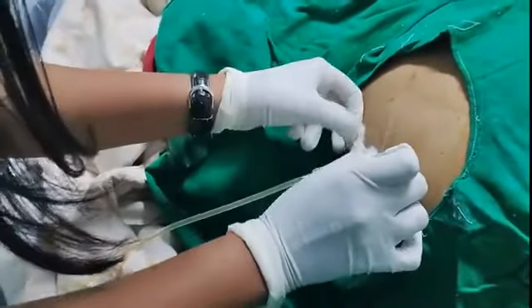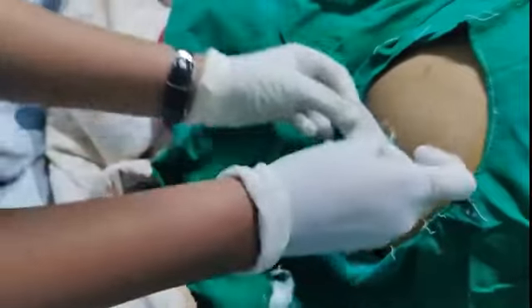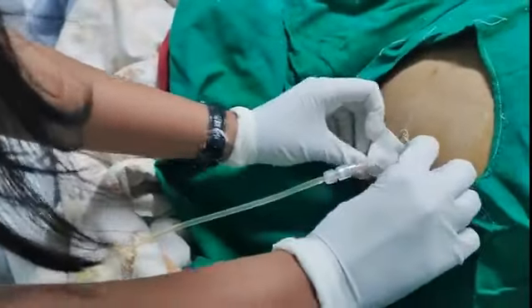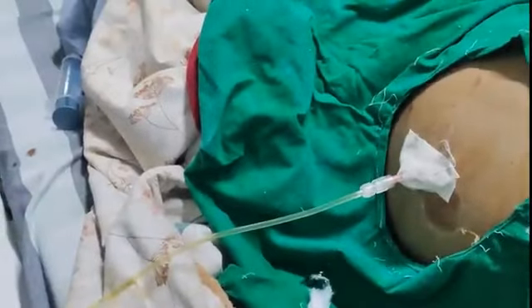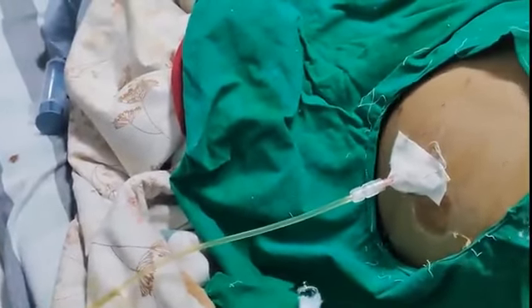For therapeutic paracentesis, if a Caldwell needle is used, advance the outer metal catheter over the needle, then remove the needle from inside the catheter. Attach the catheter to a collection bag or vacuum bottle using tubing.